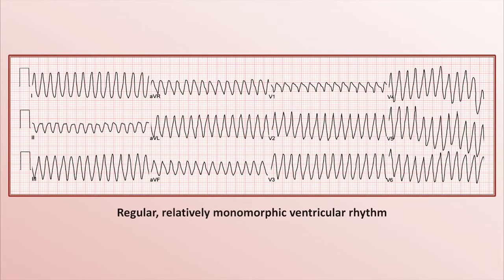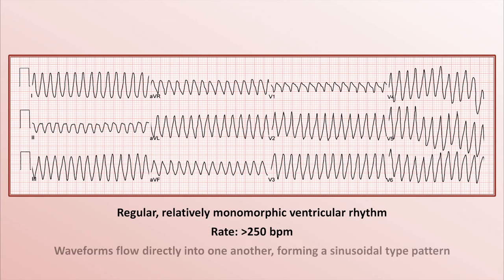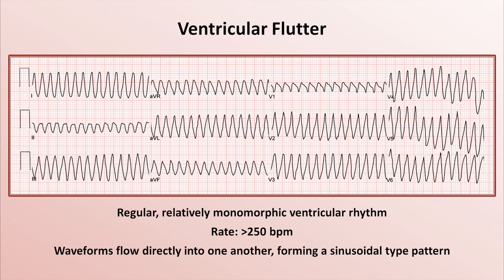The very last EKG is this dramatic rhythm. It's a regular, relatively monomorphic rhythm with an extremely fast rate greater than 250. The waveforms flow directly into one another with no isoelectric point in any lead, forming a sinusoidal pattern in which it becomes impossible to distinguish QRS from T. Sometimes this is described as the EKG looking the same upside down. This is called ventricular flutter — it's almost always pulseless and usually will quickly degenerate into ventricular fibrillation. That concludes this video on ventricular tachycardia. Please consider subscribing to Strong Medicine to check out the entire series on EKG interpretation, as well as a large collection of videos on other medical topics.